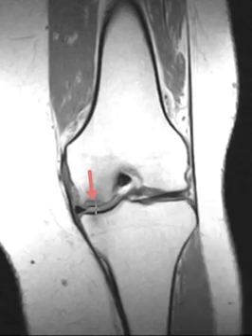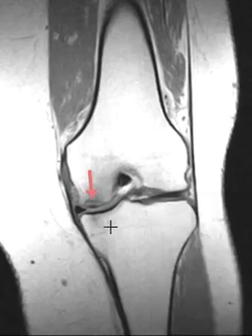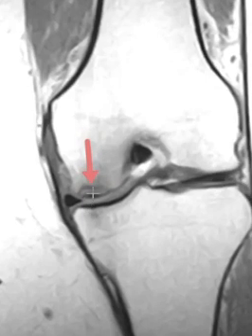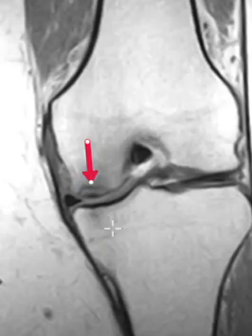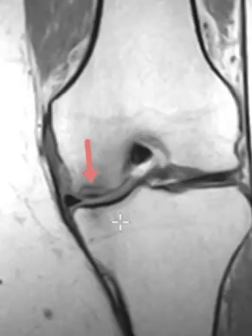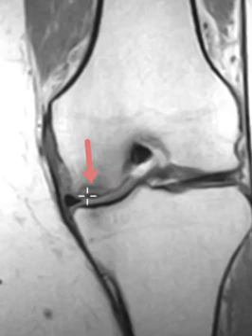Let me zoom this up. You can see this line comes horizontally across — here's the articular surface, the bony cortex. It looks like there's another articular surface here. This is a subarticular fracture line, so there's really a type of stress fracture. There's abnormal mechanics of stress and the bone is weak, and there's a stress fracture.